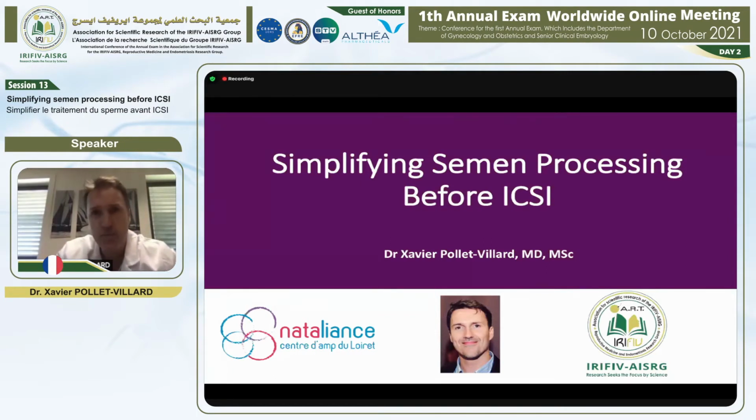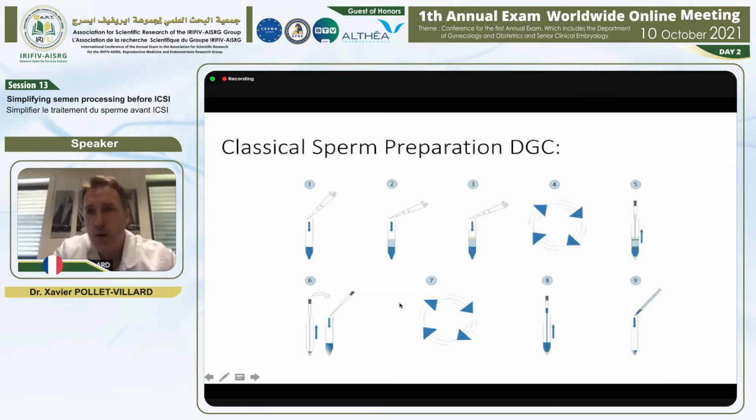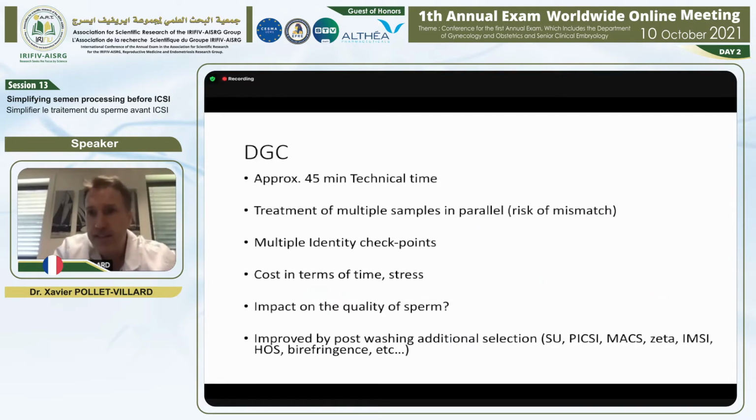Simplifying semen processing before ICSI. So we all know this scheme. This is the classical sperm preparation by density gradient centrifugation. This is the most used technique in the world in IVF centers, but it has drawbacks. The technical time is high, approximately 45 minutes.